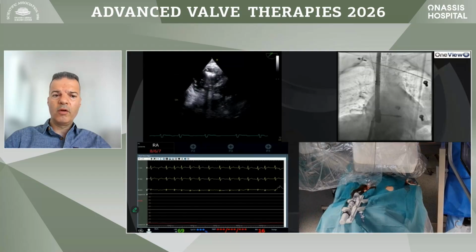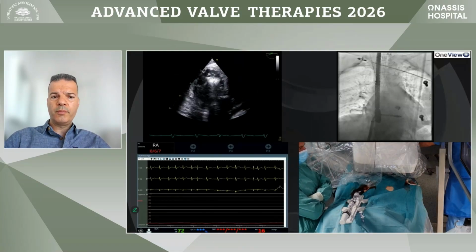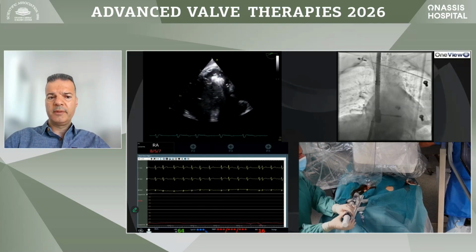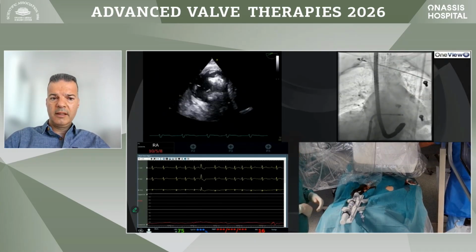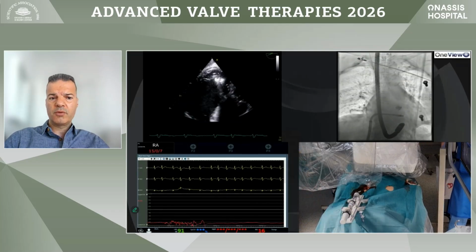And now you can see the clover that Moni Shuvy actually discussed earlier on, two tissue bridges on the transgastric. One is coming anteroseptally and the other is coming posteroseptally. Now our focus, of course, is to ensure the leaflets are in, so we can afford to open the device, look at the leaflets, make sure the leaflets go all the way into the base of the arms, and then we close the device again.